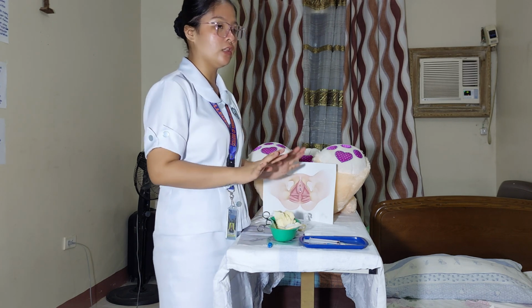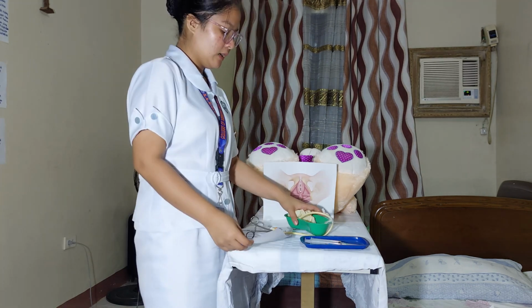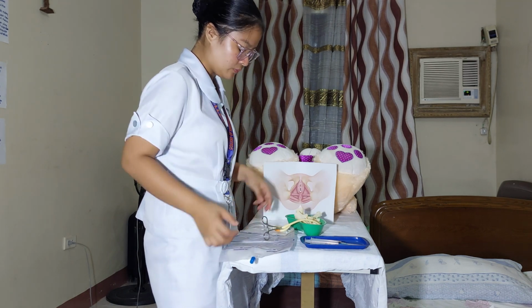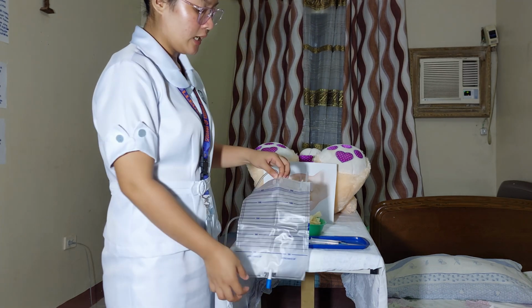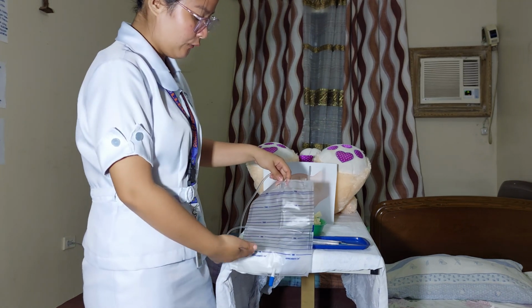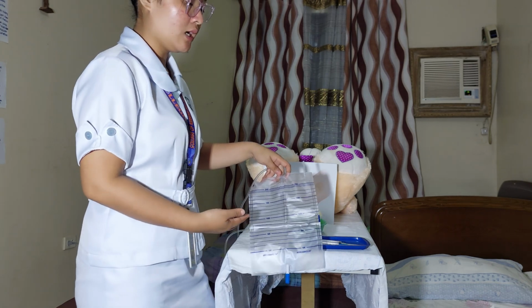So I'm going to dispose of all the materials, but before disposing of the materials, I'm going to measure the urinary output of the patient. So we can see here the measurement of the output.